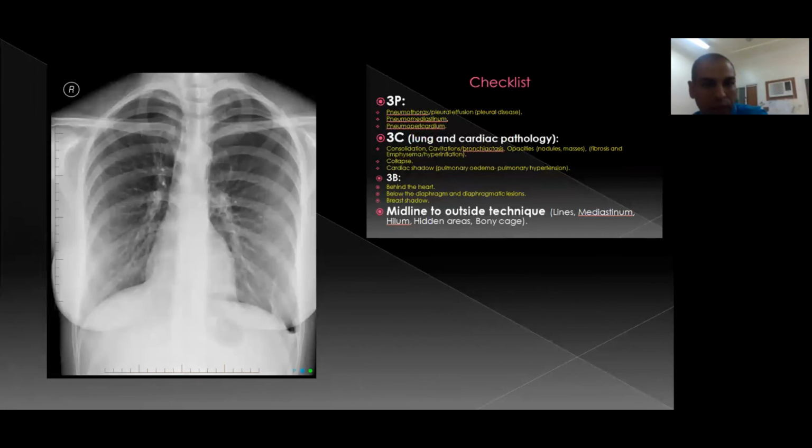Any volunteer for this chest X-ray? We need someone from the surgery department, because it is one of the important points for the surgery department.